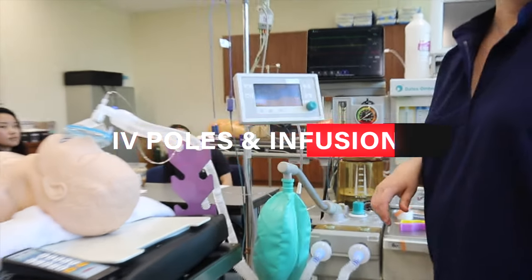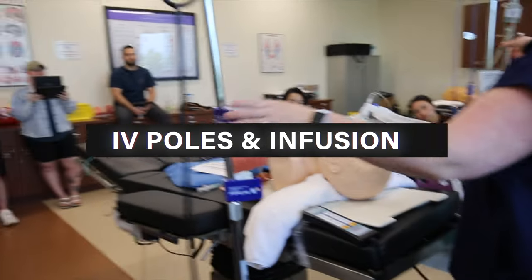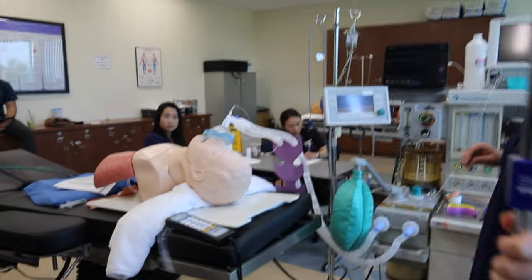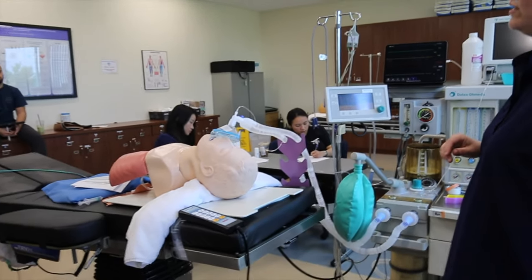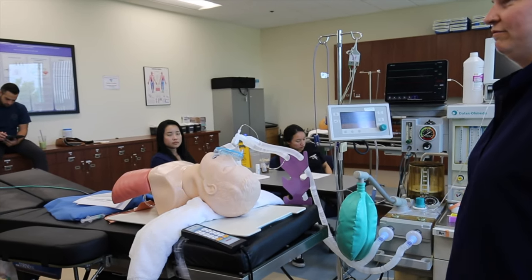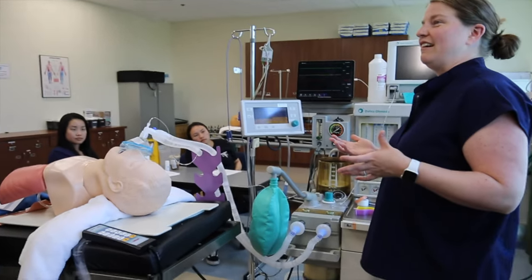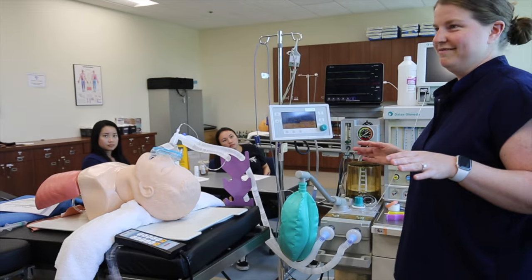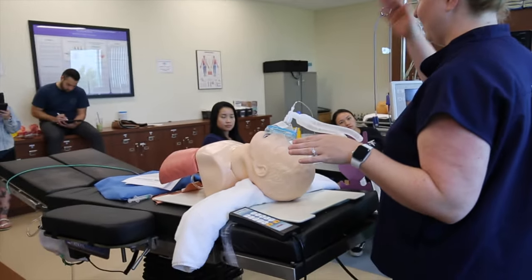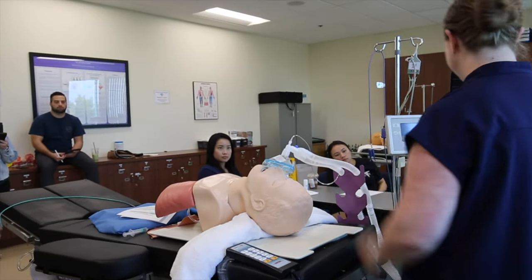I is for IV poles. You need 2 IV poles that have a clamp on them so that you can secure the drapes when they come your way. Other parts of I, the IV infusion, so you want to make sure that the patient has an IV bag with a working IV. The days of you pushing drugs with a flush are over. You will be pushing into IV bags that are just continuously running, and you're just going to push into the stream of fluid that's bolusing from the bag.